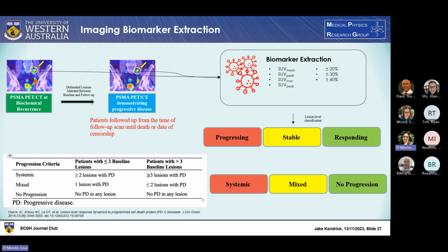Now, I should point out, we don't know that this is the best way of doing this. The point that we set out to do as we started this study was, well, we want to set the criteria that we want to use before we start looking at the data, because we didn't want to bias the results for our particular data set. Right, so this is why we chose this framework. As I said, it wasn't actually even developed for metastatic prostate cancer, but as we'll see, it does have direct relevance to it.